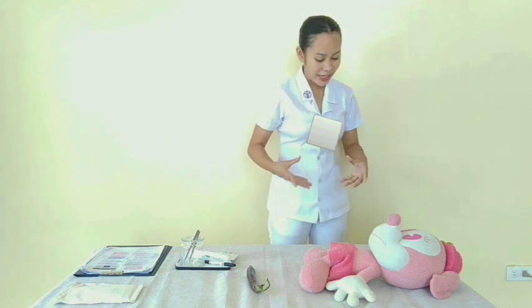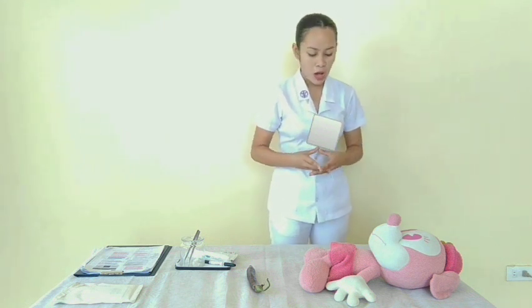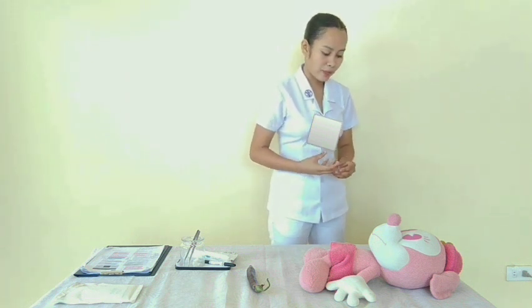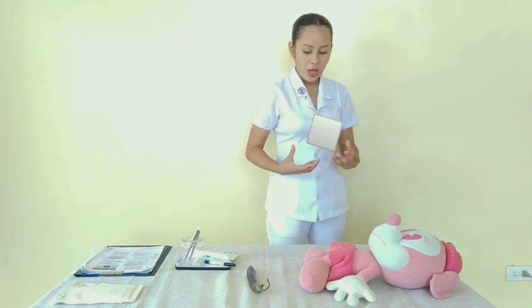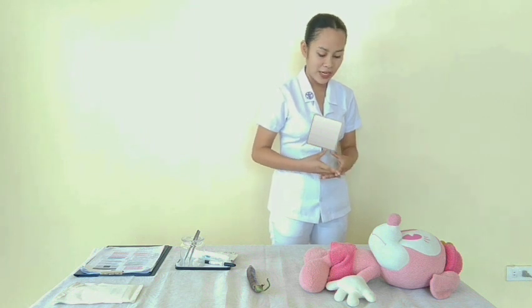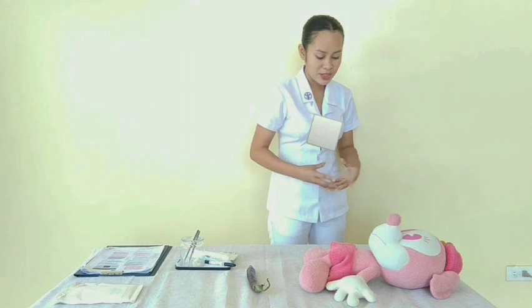This medication will produce a small wheal, like a small raised area, like a blister. You will feel a slight prick as the needle enters the skin. The purpose of this skin testing is to test if you have allergies to the medication. Okay? Do you have any questions or clarifications, ma'am?